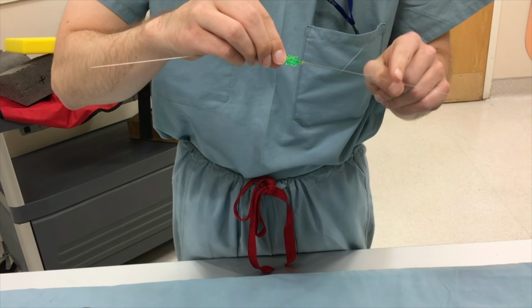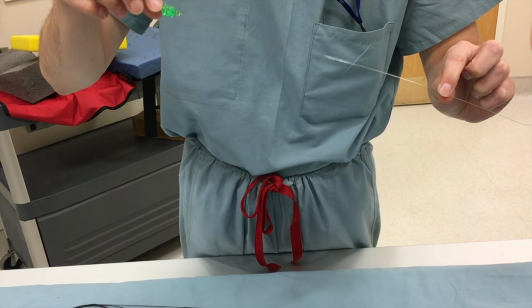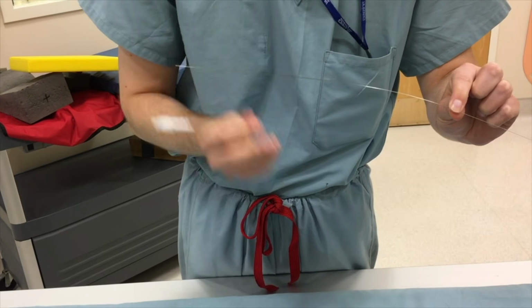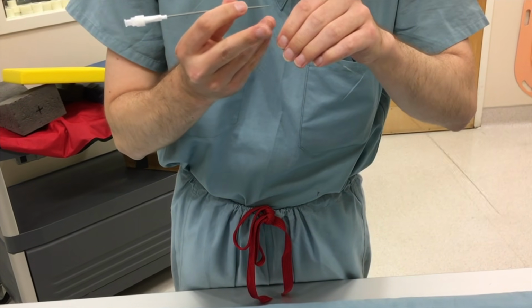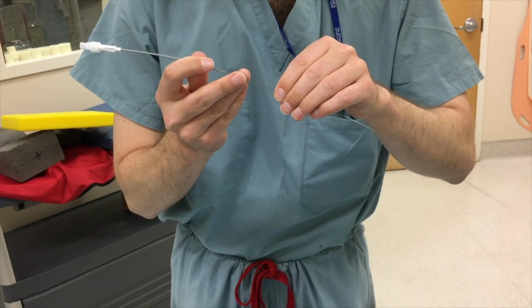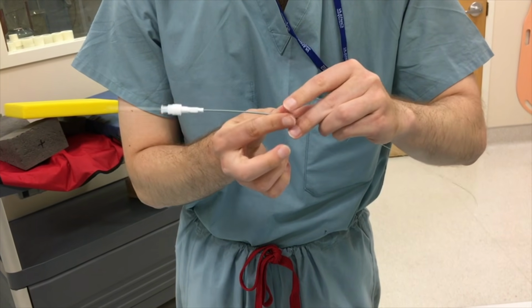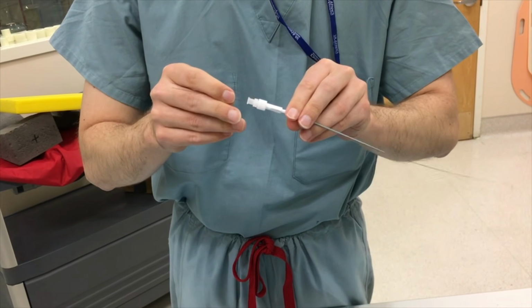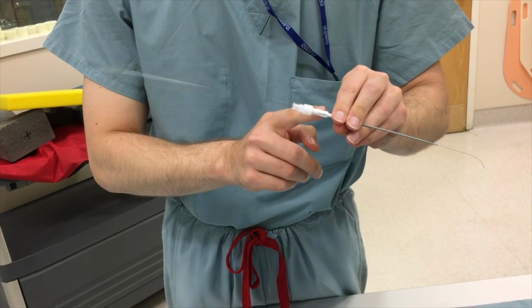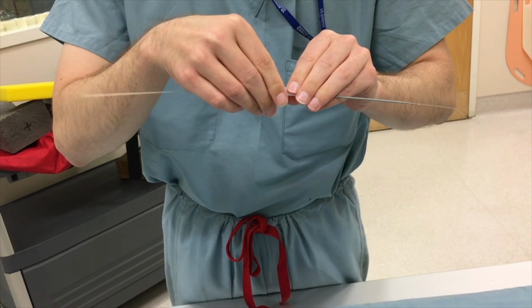Now the wire is in the artery here. So you maintain that access. You can pull the needle out over the wire. So now you still have access here in the arterial system. Then you take this 5 French catheter, which can fit over this wire. You thread this through the wire, and then you get this into the arterial system. So now you have a 5 French catheter, and through that a 0.035 inch wire can go.